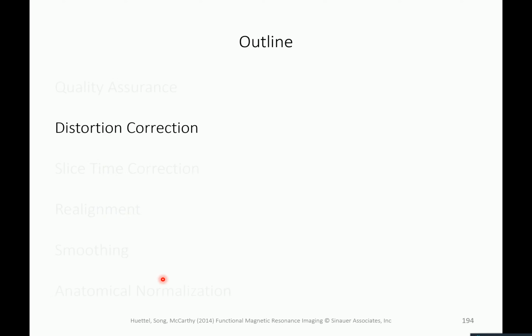And of course, looking at these raw images is a first thing in data analysis and quality assurance, because if you have a lot of spikes in your data and you don't look at the raw images and then analyze your data, it will be funky and nobody knows why, and it's weird. So look at it. That's quality assurance.